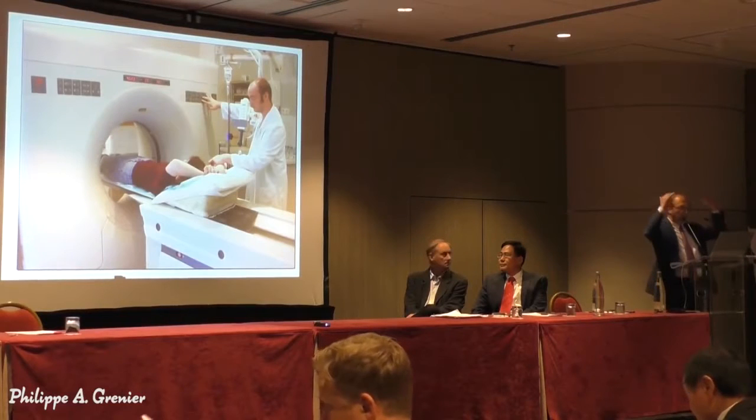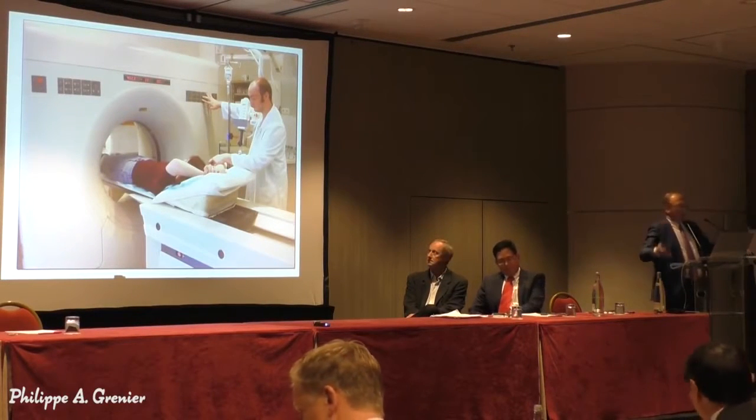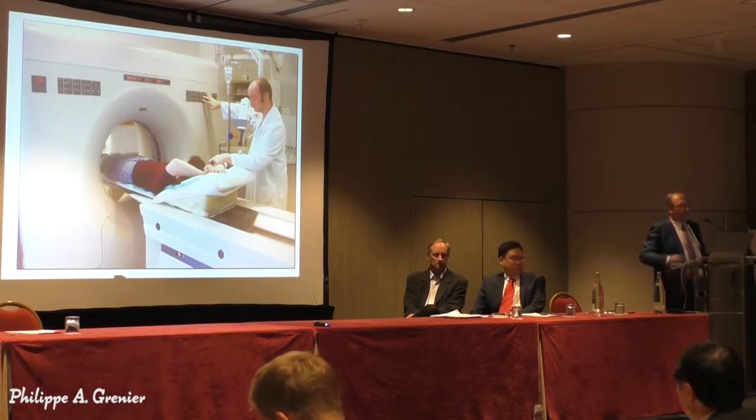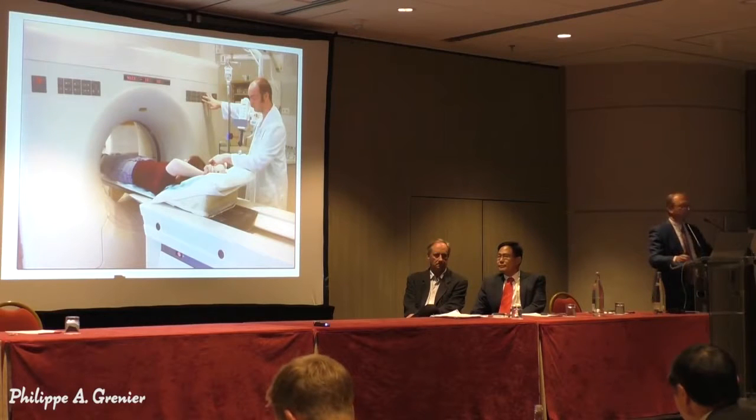The arms are in an upward position to avoid artifacts. If you put the arms along the body, you have a lot of artifacts. That is not very comfortable, but this is necessary to have good images.